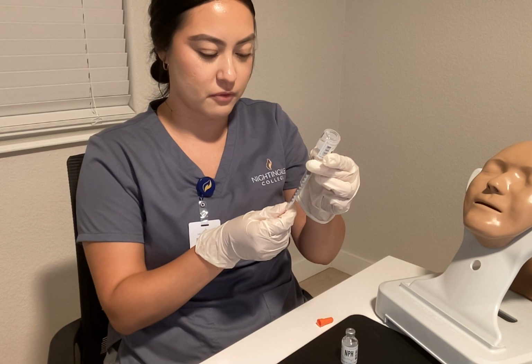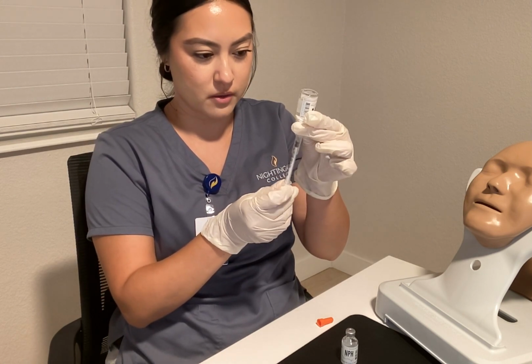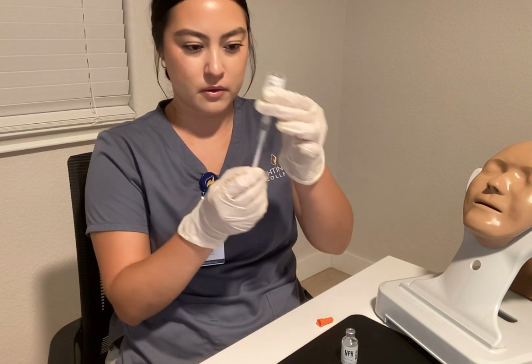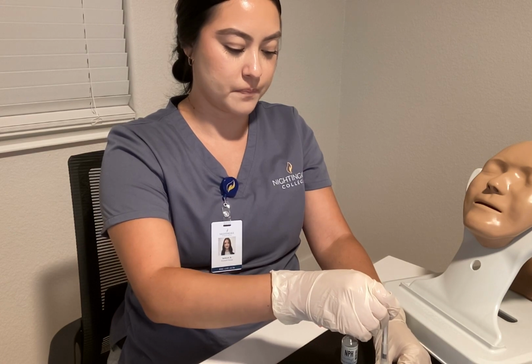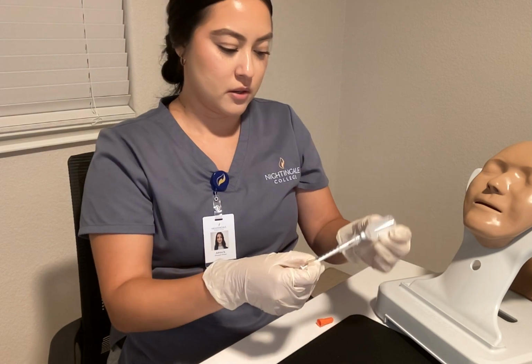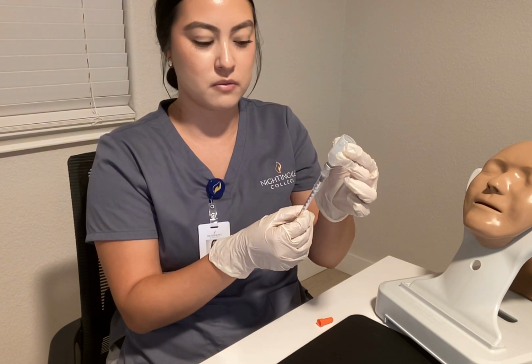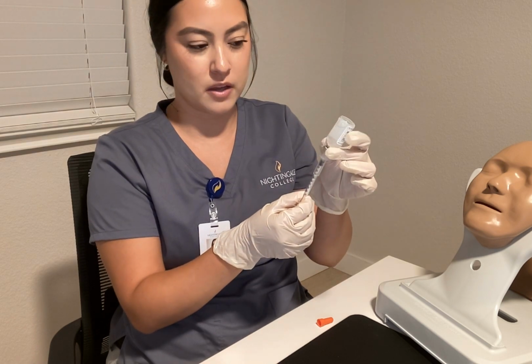Again, this is going to be 4 units, and the nurse is verifying behind me as well. Okay, so again, nurse has verified that is 4. We're going to take out, and we're going to inject into our fast-acting. We want to be careful that we don't overdraw our fast-acting, because we can't push the medication back into the vial. We do not want to mix these back into this vial, your fast-acting.